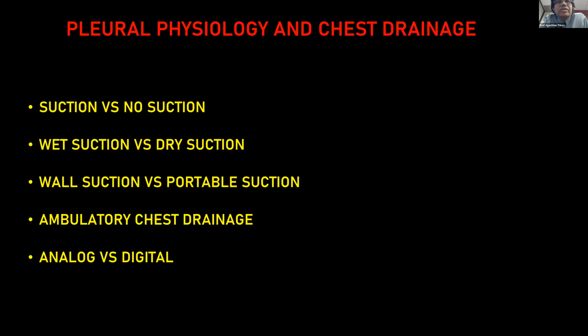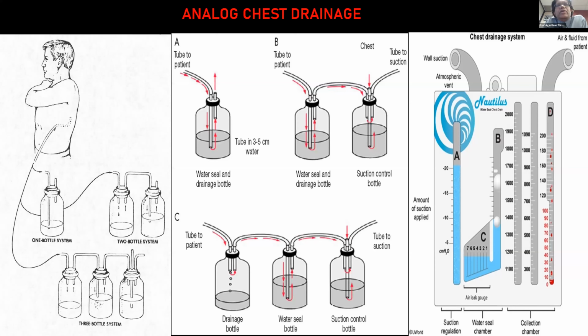Whether you should use ambulatory chest drainage. And that's what controversy is always: which is better? Is analog chest drainage better, or is digital much better? So if you look at analog, you see the evolution of the analog system.